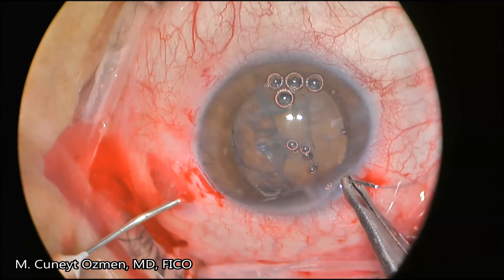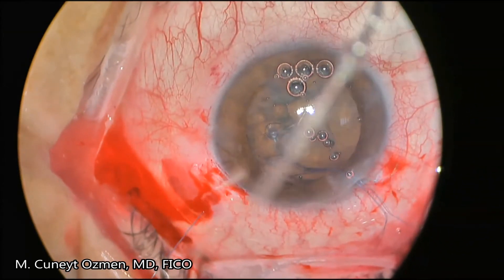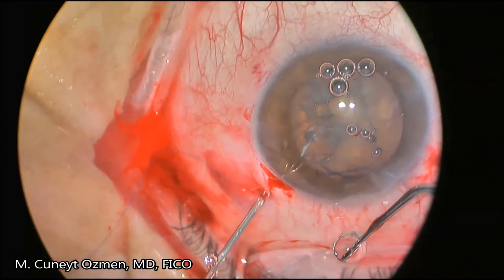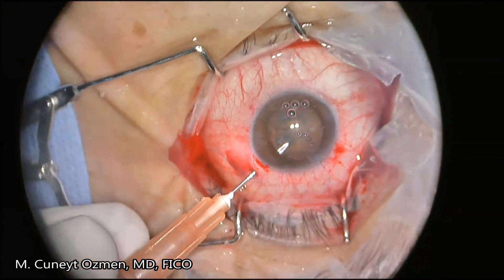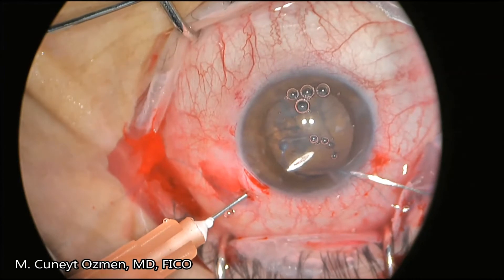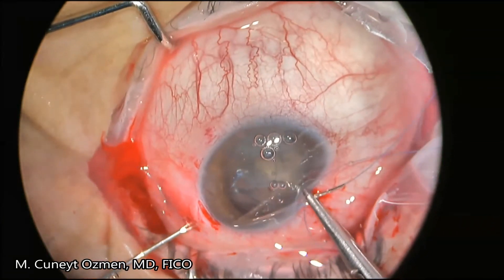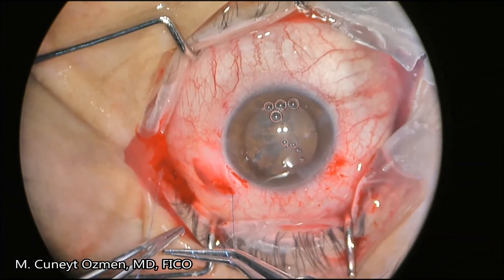I'm using a 26-gauge needle here as a guide for the PC-9 needles and I am pulling them transconjunctivally. After pulling both PC-9 sutures transconjunctivally, about 1.5 mm posterior to the limbus and about 1 mm apart from each other, we can then tie them temporarily onto the conjunctiva.